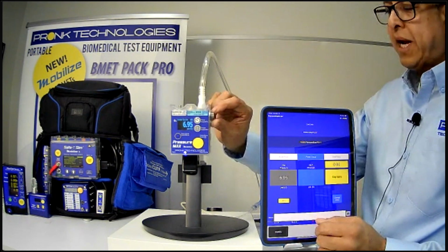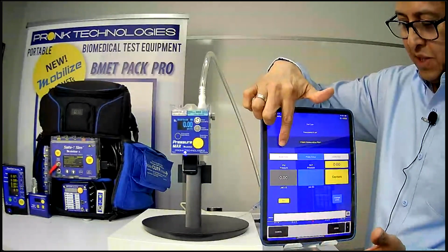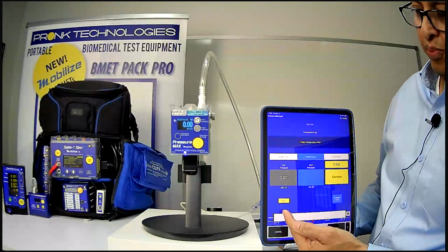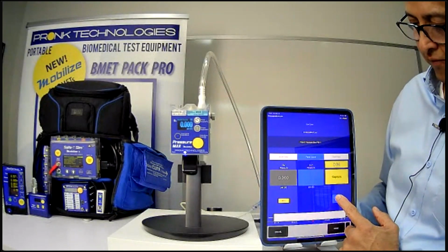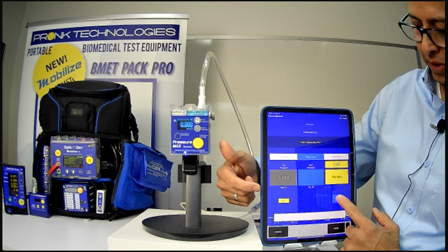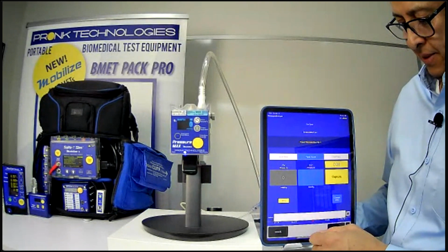So the way it's set up, and I'll go ahead and release the pressure so we can start from the beginning, is you have a menu option here which you can utilize to do a leak rate test if you need to. You could do a pressure accuracy test if you're checking pressure, verification of pressure, you're doing a calibration of adjustment. I could zero the pressure transducer from the Pressure Max from here. And I can also change the units of measure from here as well. So if I want to do it in a different unit of measure, you'll see here on the left, the unit of measure changes. So I'm able to select any unit of measure I want. So I'm going to go ahead and just select millimeters of mercury. So I am in control of the Pressure Max from the Mobilize app, and I'm able to do some tests.